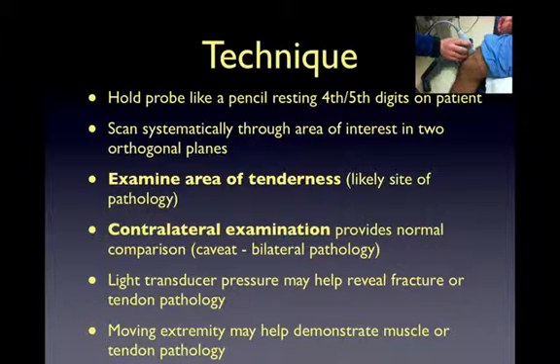You also maybe want to sometimes apply light transducer pressure, which may help reveal a fracture or tendon pathology. And sometimes having dynamic examination, having the patient move the extremity may help reveal muscle tears, ruptures, or tendon pathology, so that can also complement your exam.